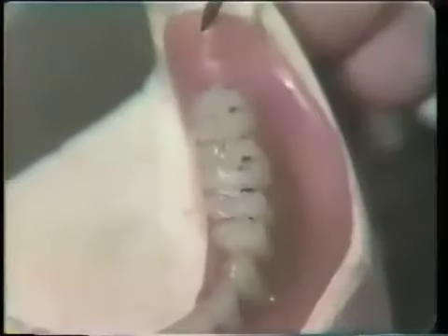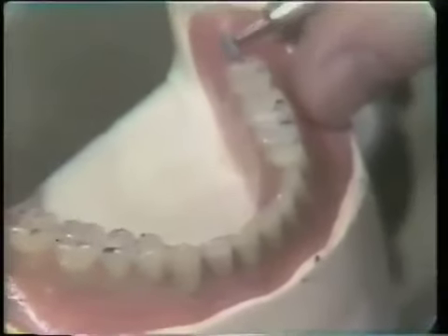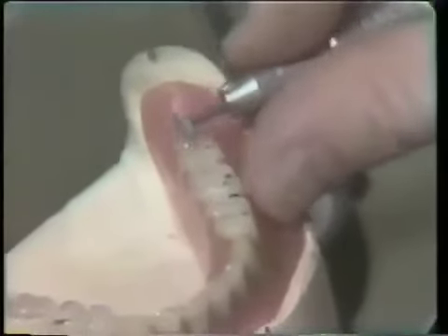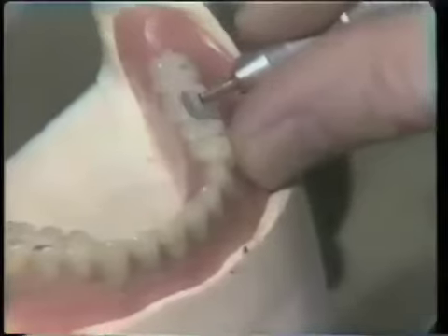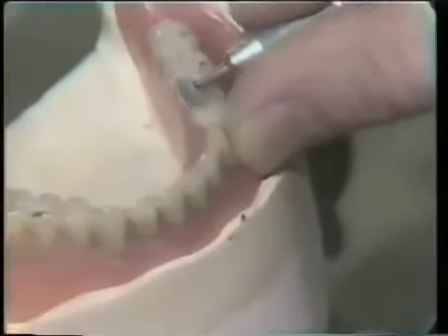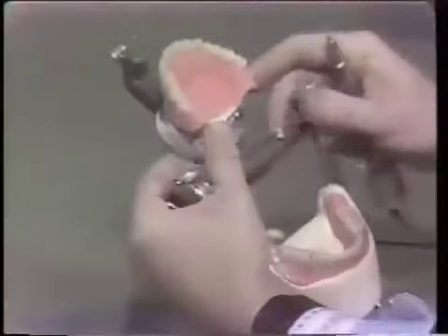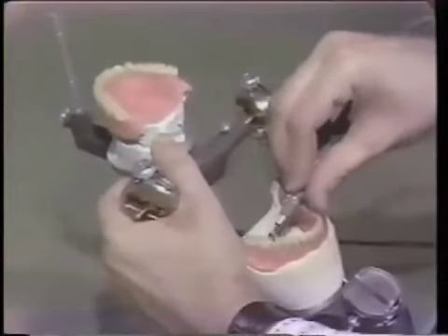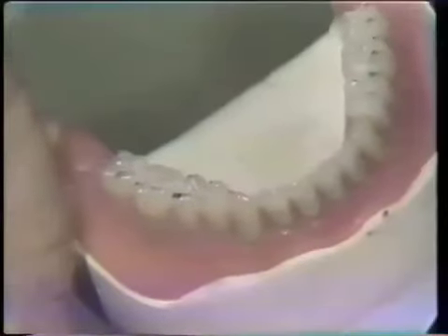We now have contact on cusp tips and it does feel quite solid. I'm very close to considering that in centric occlusion I have all the teeth contacting — there are marks on all the teeth and no teeth are completely out of occlusion. We don't want to reduce the vertical dimension. As we discussed in lecture, selective grinding is used instead of milling because we have a selection — whereas milling simply takes down all surfaces equally and reduces the vertical dimension quite rapidly.